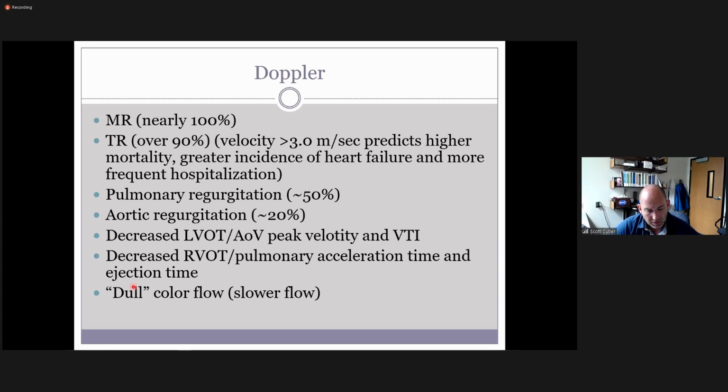But as I was talking to Tammy yesterday, it's often harder to do a limited exam than it is just to put your brain in neutral mode and just go with it, doing your regular protocol. So when you have to think about what's relevant, this one's a little bit more of a general process, and so is hypertrophic cardiomyopathy. But some things like certain valvular diseases, or if you're looking for a certain congenital process or connection issue, it might be a lot more specific to what you're looking for. So some things are going to be more specific, some things like this are going to be general.